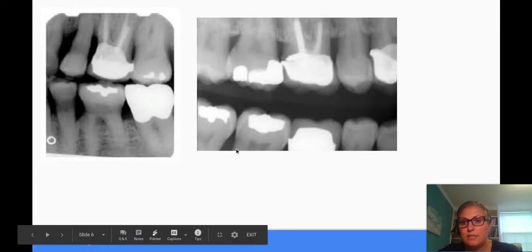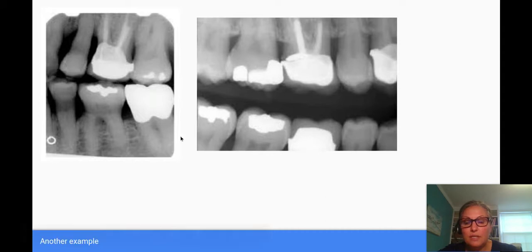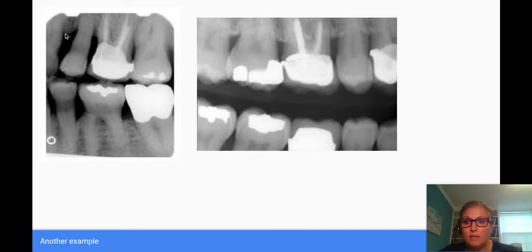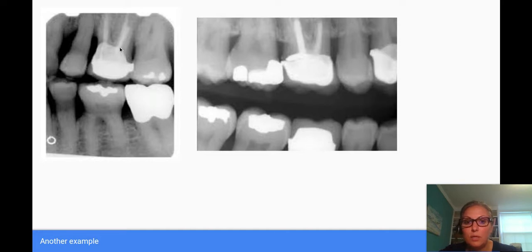Here's another example of details that could have been missed. See how beautifully detailed this radiograph is. Do you see this premolar — the height, or how much bone has been lost here? That's significant. The PDL is pretty much non-existent at this point, and we cannot see the PDL well on a horizontal bitewing.